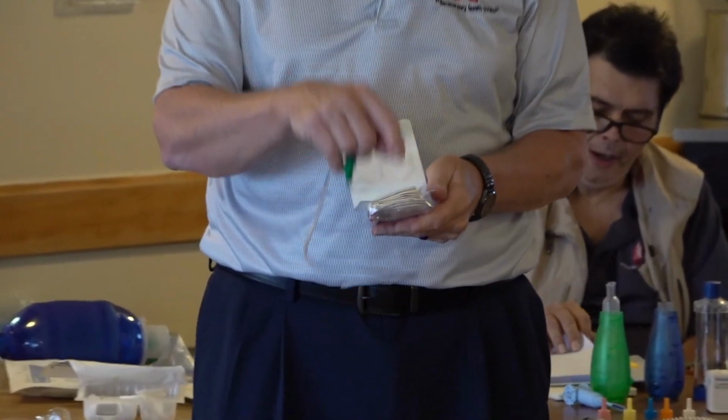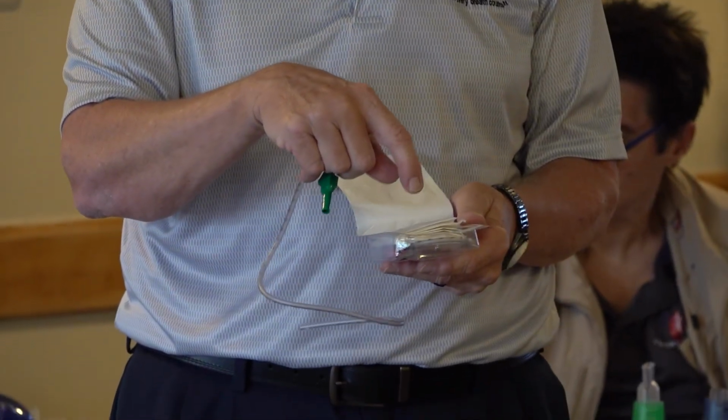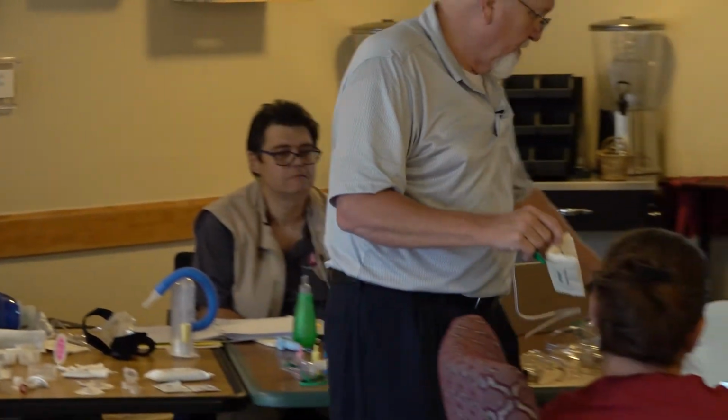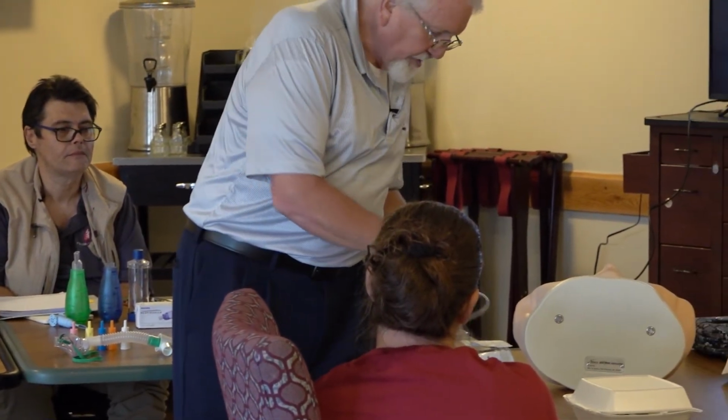Again, the process for this: you open your pack, and the first thing you're going to take out is your gloves. When you're doing that, be careful not to touch the catheter. Everything in here right now is sterile. So we're going to take this out, open it up, and spread it out there. I've already got everything set up.